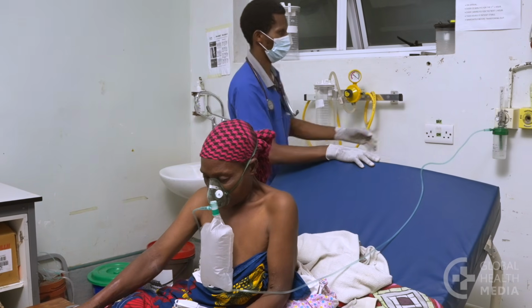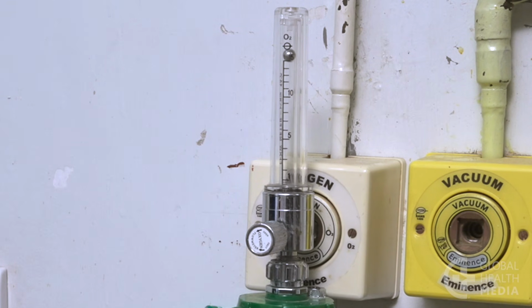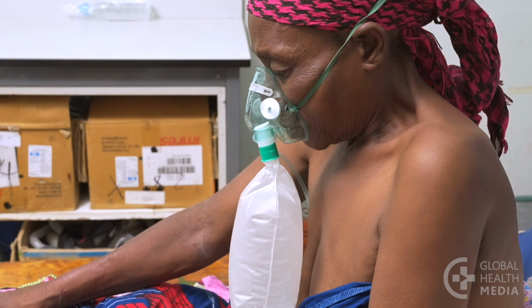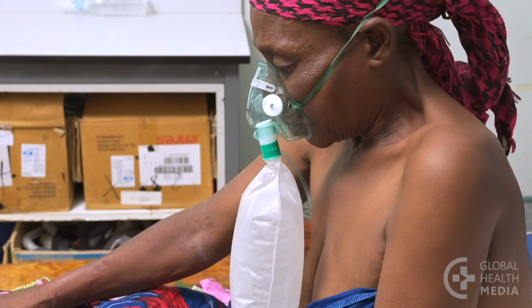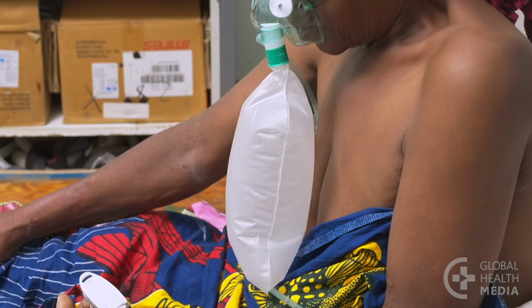Increase the oxygen flow to 10 to 15 liters per minute. The mask should cover the bridge of the nose and extend below the lower lip, but not past the chin. The non-rebreather mask provides close to 100% oxygen if the reservoir bag is full.